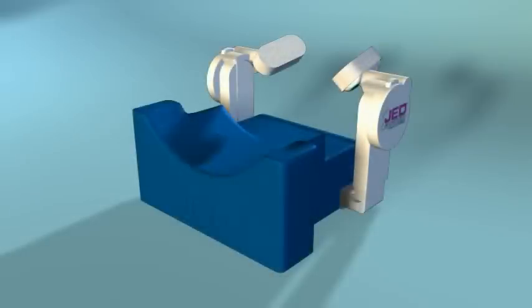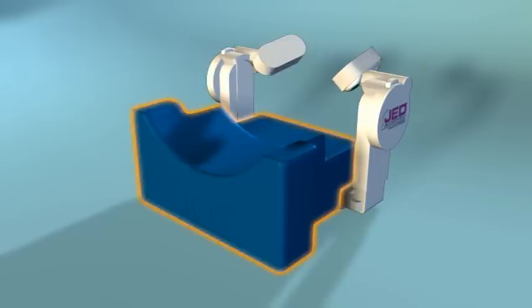The JED jaw elevation device is an externally applied, non-invasive device that contains no metal and is MRI compatible. The head support comfortably secures the patient's head in a forward position. The memory foam is designed for the highest level of patient comfort.